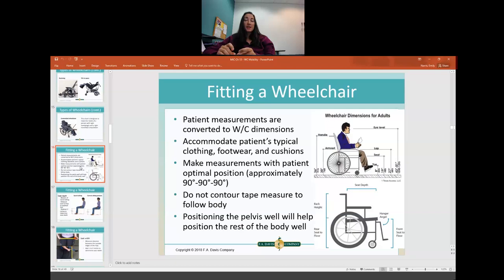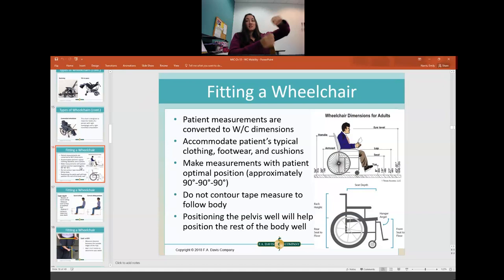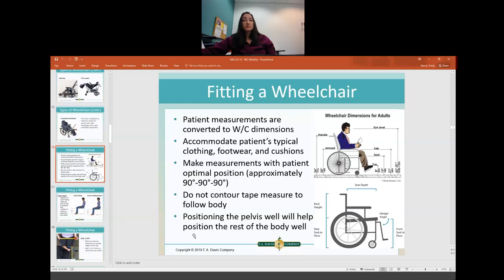For proper fit of the wheelchair, we measure the patient's body and convert it to wheelchair dimensions. We typically have them in their usual clothing, footwear, and with whatever cushion they're going to use so we can get accurate dimensions. We measure them in a good sitting position — they need to be sitting upright, not slouched. We do not contour the tape measure; you keep it straight like a ruler and position the pelvis well, and the rest of the body will follow.